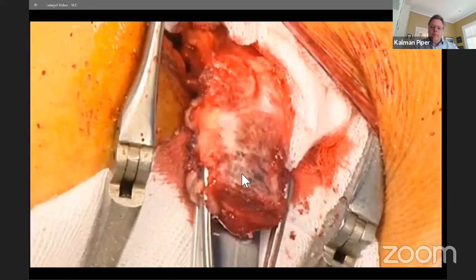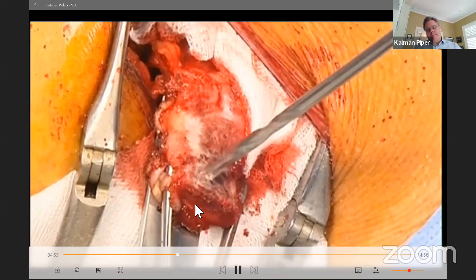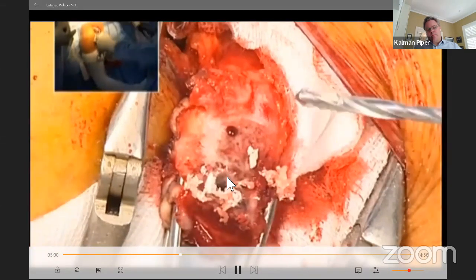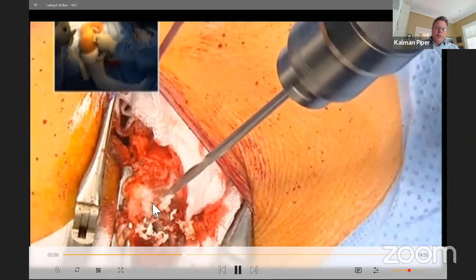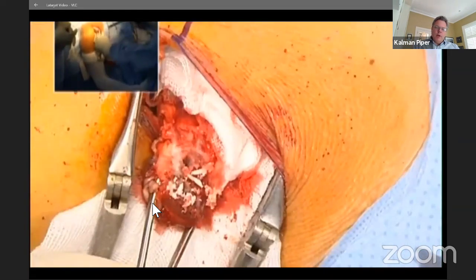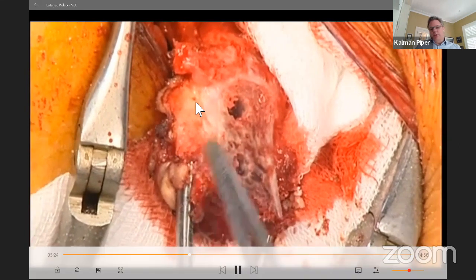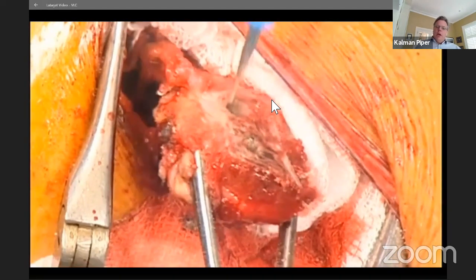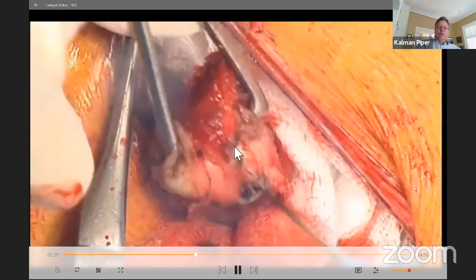Next step is to prepare the graft with the inferior screw hole and superior screw holes. He's placed a Bristow underneath the graft so that the drill doesn't plunge through the graft and into the patient's skin. And that completes the preparation of the graft. That's ready to be placed onto the medial glenoid neck. That's the CA ligament to which we'll stitch the capsule at the end of the procedure. So that's placed. He's just now identifying the screw holes on the other side of the graft. Sometimes they can be hard to see because there's still a lot of soft tissue attached to the superior surface of the graft.